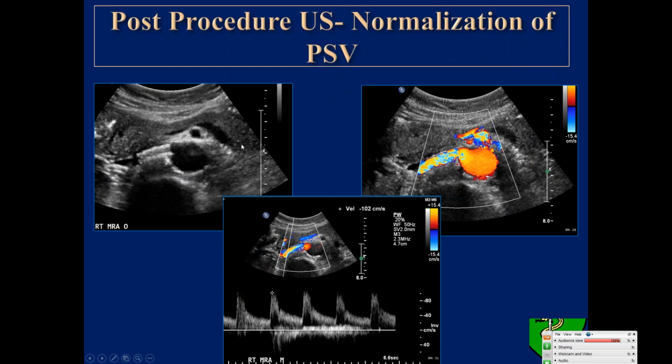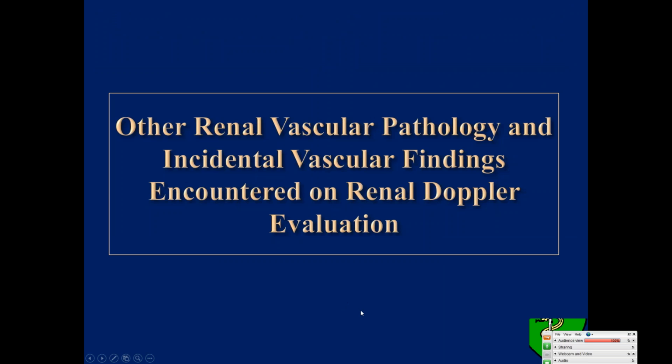After the procedure, the patient returned to our ultrasound suite, and we evaluated this patient, and we saw that now the stent is filled very nicely with the color Doppler, and the interrogation of the stented portion of the vessel demonstrates normalization of the peak systolic velocities.